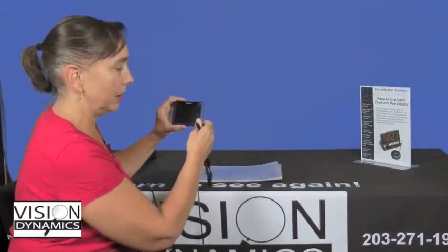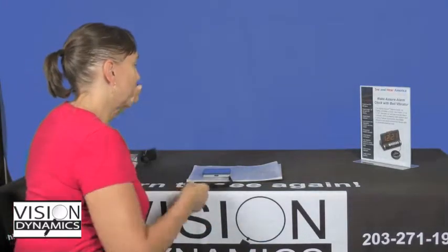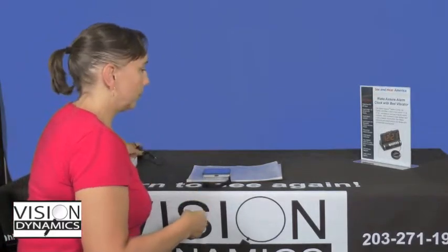That's nice because you never want to be out and about at a restaurant and you forgot to charge it and you don't have your Mini available to use. So like a cell phone, if you're a cell phone user, just get into the habit of keeping your charger plugged into the wall, keeping the little plug ready to go, and have it ready to plug in at night when you're ready to charge it for the evening.